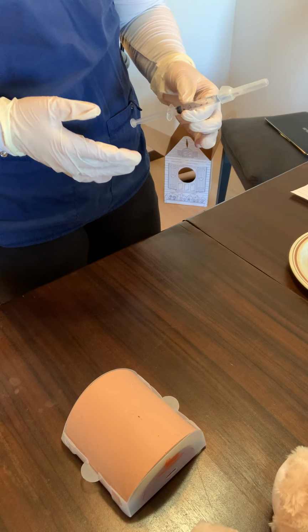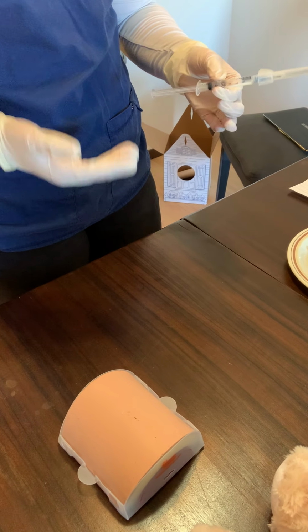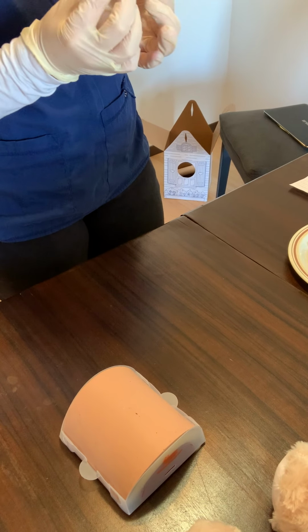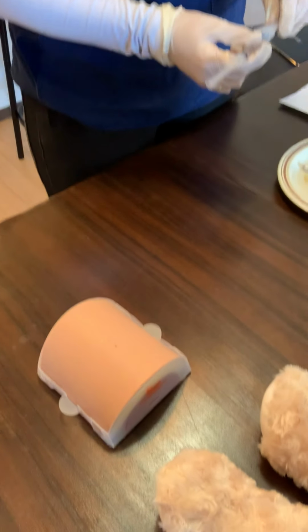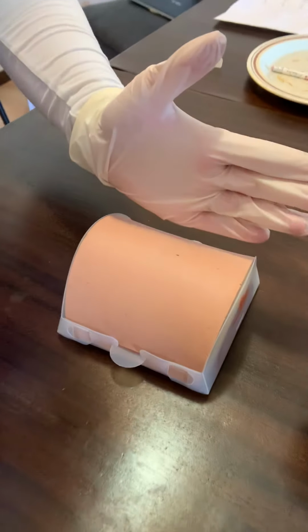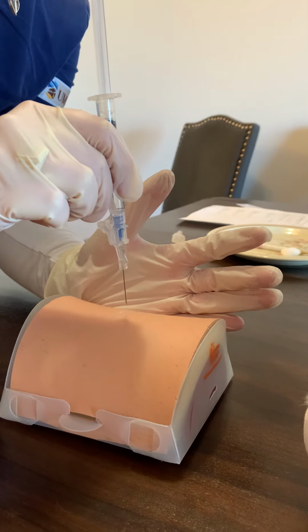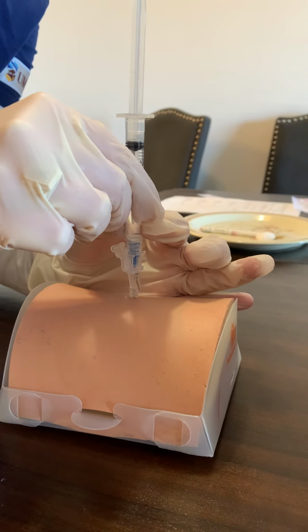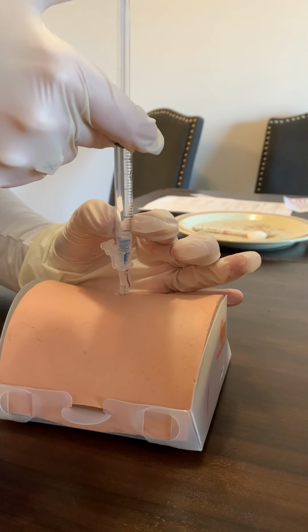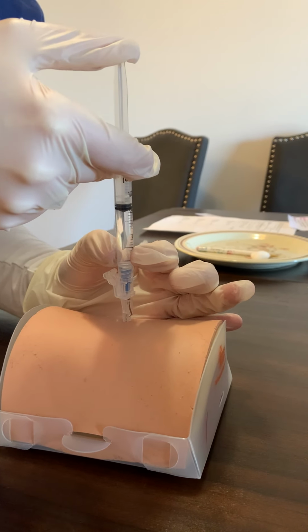If there was blood, it's an indication that I'm in the wrong place, so I would have to restart. But like I said, I do not have to do that. So I will take the cap off. I will Z-track, pulling the skin across like this. I'll be darting it at a 90-degree angle, stabilizing, and not aspirating. And I will be slowly administering the medication.